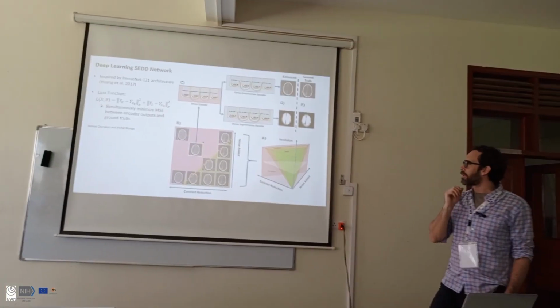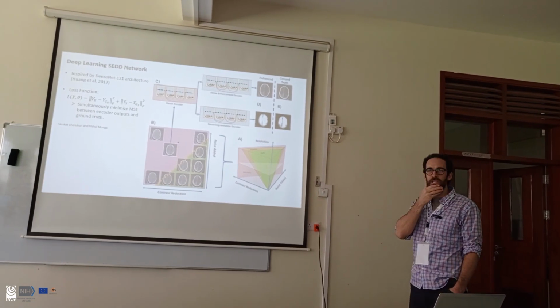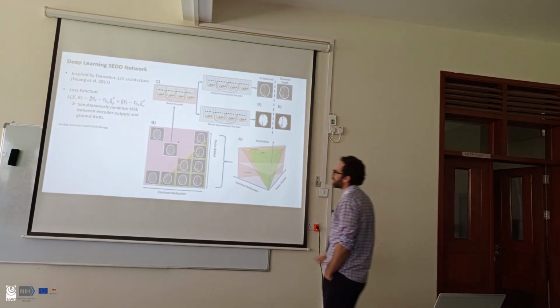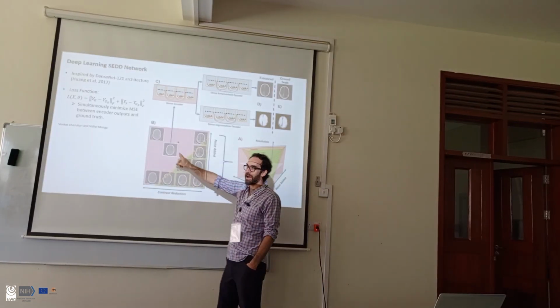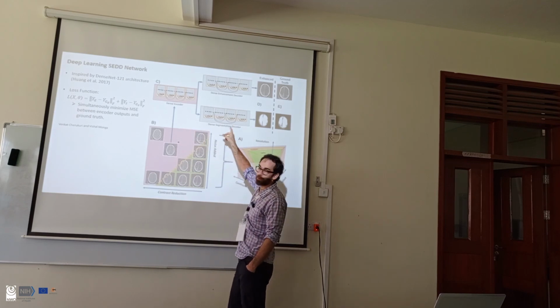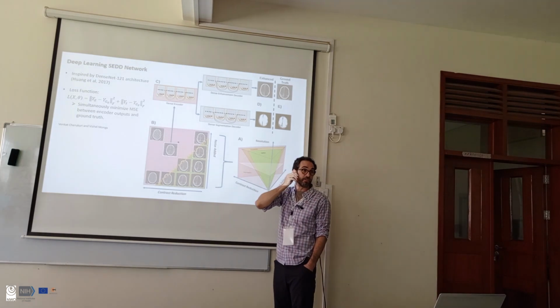We can take it a step further, and we can say, well, let's say we use some machine learning to improve the image quality. Could we actually take an image that's in the bad region, put it through, say, a deep learning network, and output an image that is good enough to use? And we did this too.